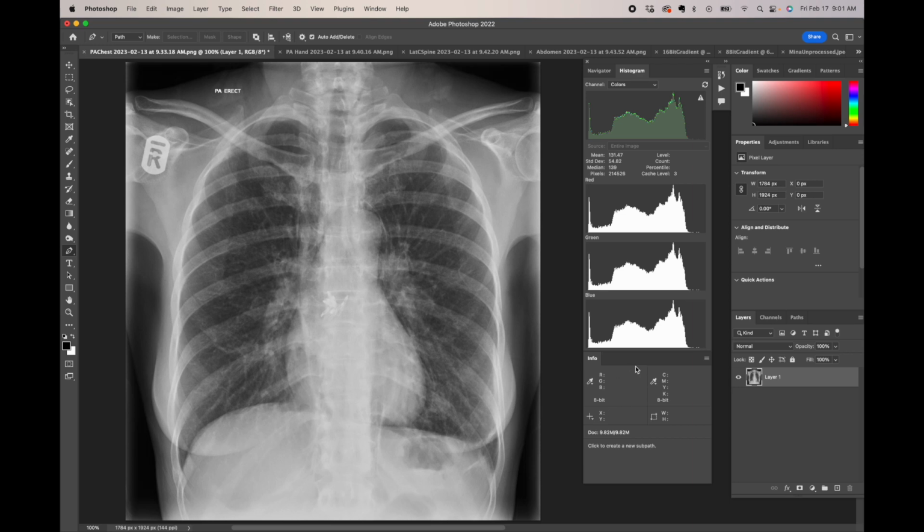So the importance of these numbers comes into play for photography, because if you recall, Pascal taught us there's 256 shades of gray, from black to absolute white in an 8-bit file.